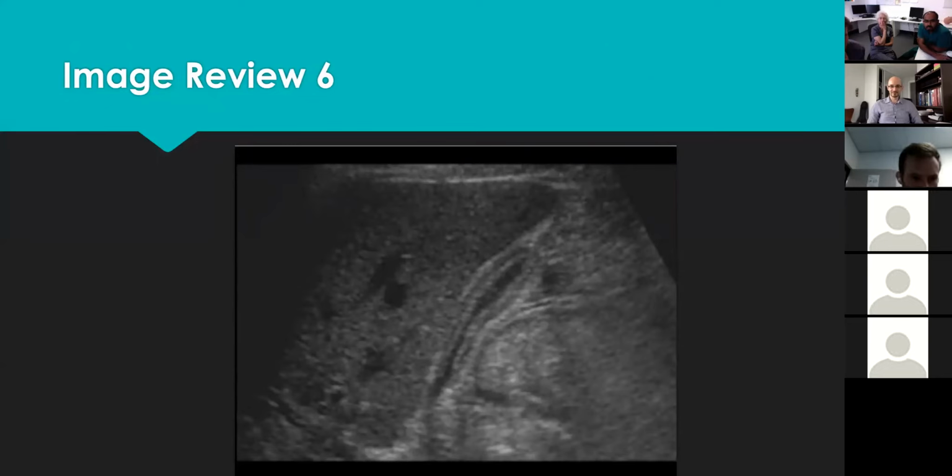So yeah, this looks like a gallbladder in the long axis, and it's contracted. The walls look thickened, but it could just be normal because of the contraction, like post-meal. I can't see any stone or sludge, and there's no echogenic change in the wall suggesting any edema. So I think it's normal. Excellent. Good job.